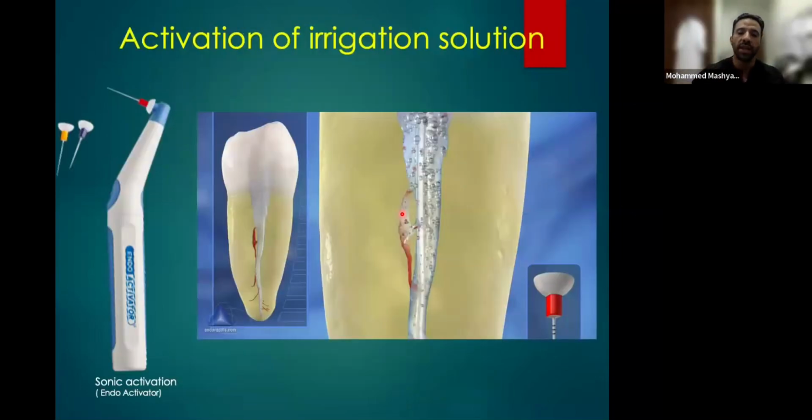Also, we have to have some activation sources. Activation, I will show you a video of how that works. Look at this video, please.